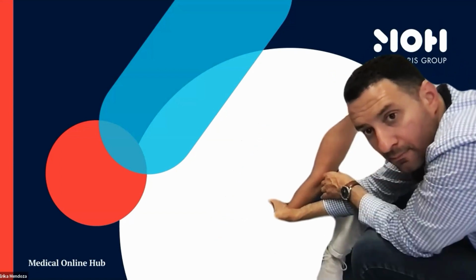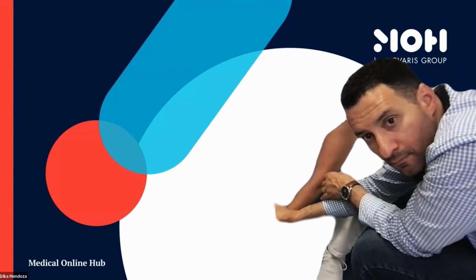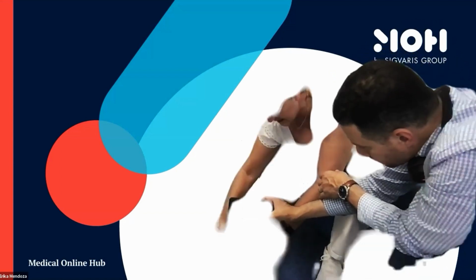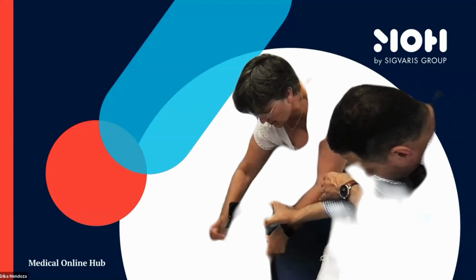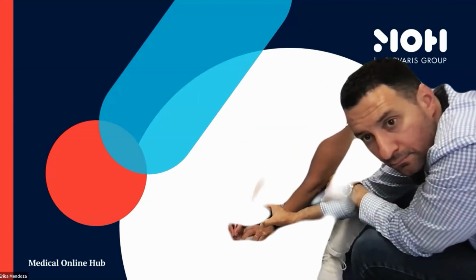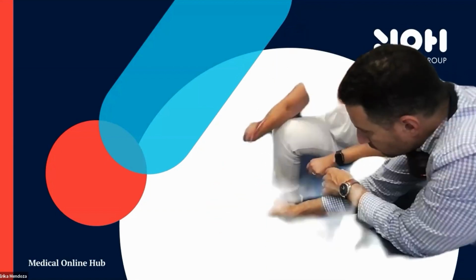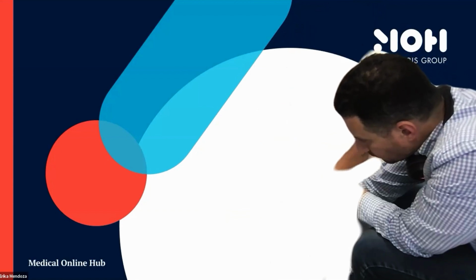We expect the perforating vein, for example, here. This is a typical case, going out here, going down here. But in this case, we have a seldom situation with the perforating veins below the tributary. So we have the reflux from the deep vein. We have a dilated great saphenous vein antegrade, and then the tributary. And the complete great saphenous vein has the antegrade flow. So it would be a pity to destroy it anyway.